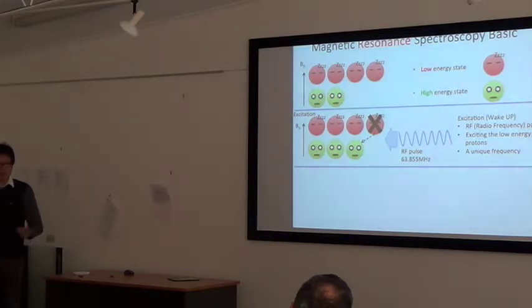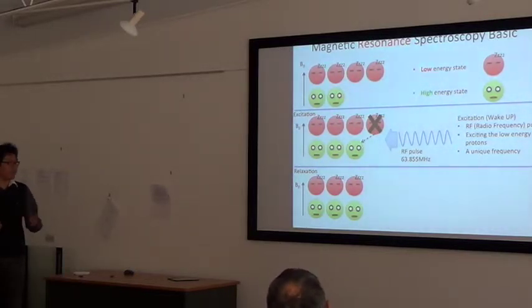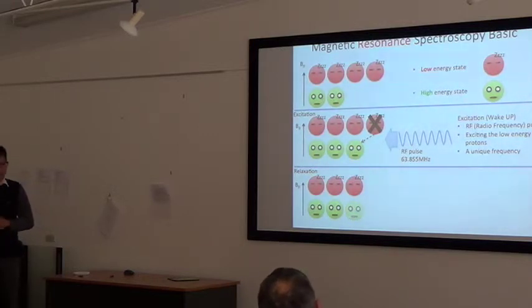And once they wake up, we switch off the wake up signal, and we come to the third important phase, which is relaxation, getting relaxed. So remember the person who just woke up, they want to go back to sleep. Why? Because of the external magnetic field, because of my talk. I'm still talking about physics.